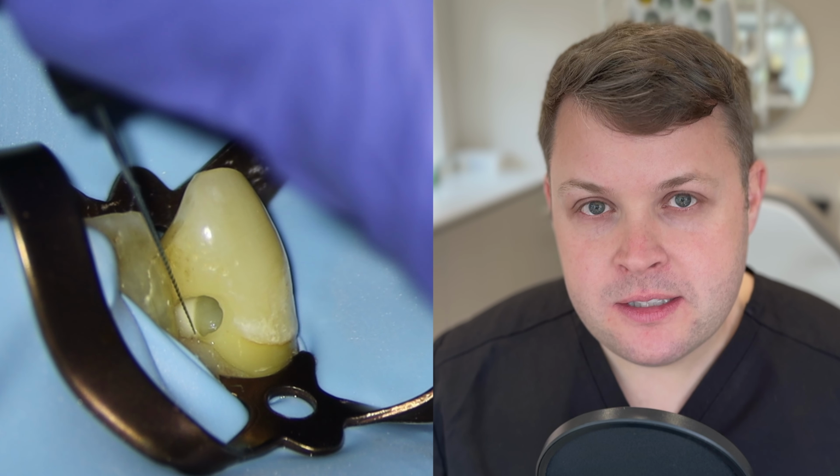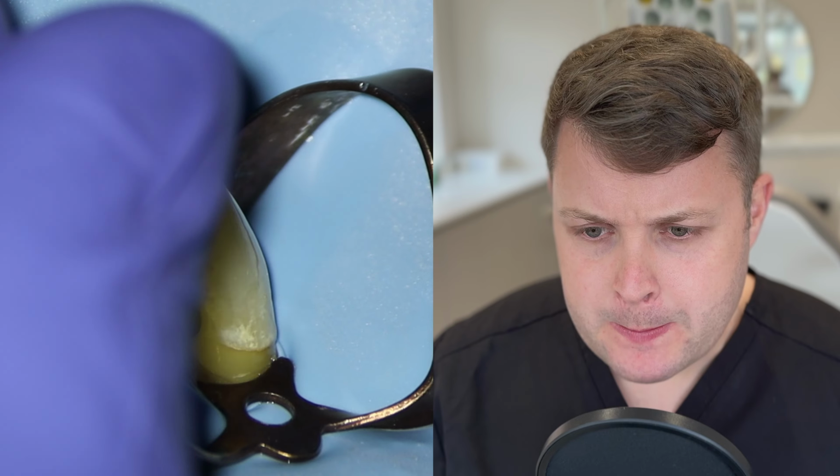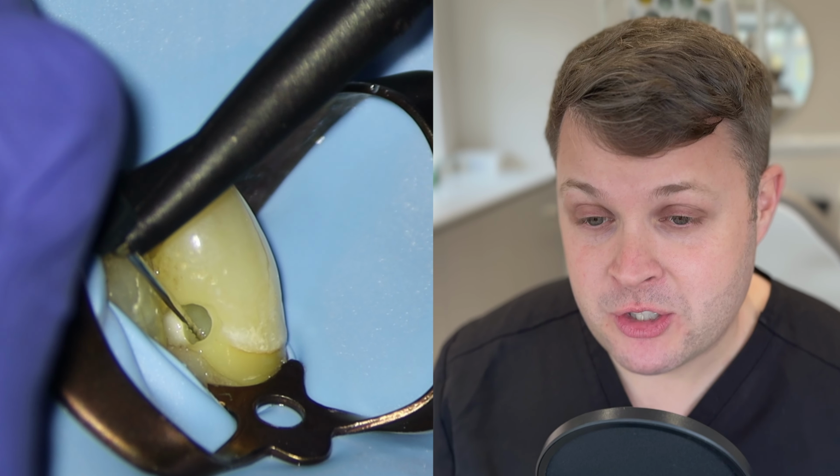So hello, welcome to this week's Friday clinical case, and this is a case where I'm trying to be clever but it doesn't work out essentially. But yeah, there's a lot to be said about doing these unusual access cavities, because there's always a bit of a balance, isn't there, between making sure that we preserve as much of the tooth tissue as possible, but also being able to carry out the treatment that we've intended to carry out. And what you'll notice here is that I try to preserve as much of the tooth tissue as possible, and then realise that it just isn't working out, and then I'm going to have to do a conventional access cavity.